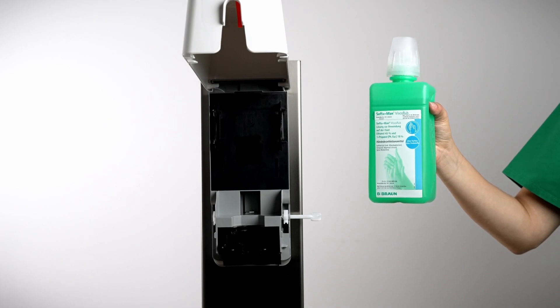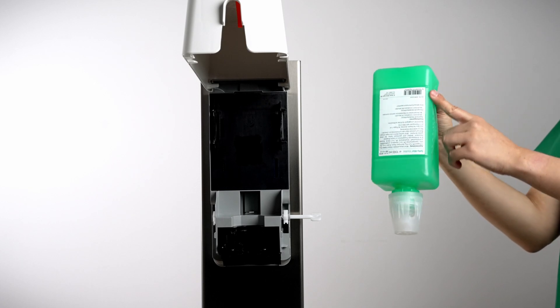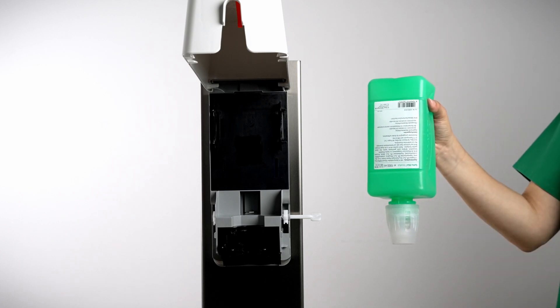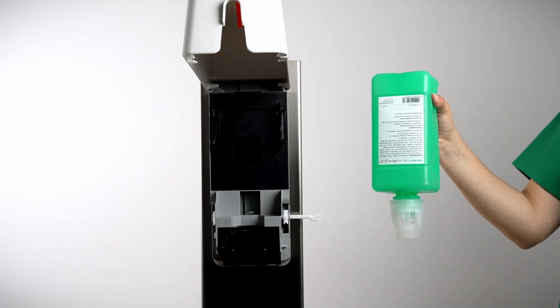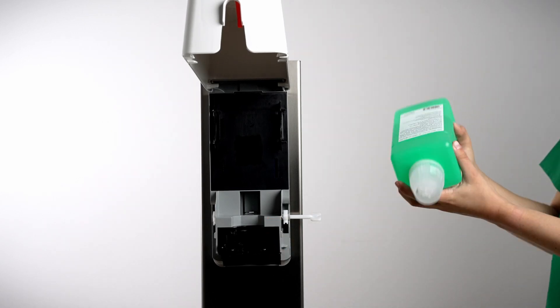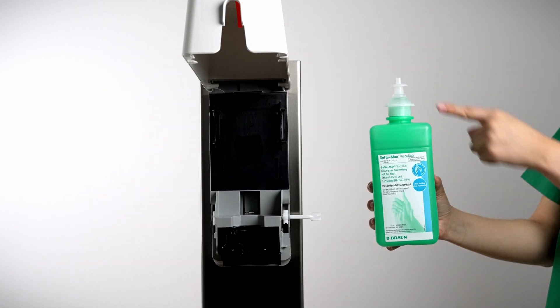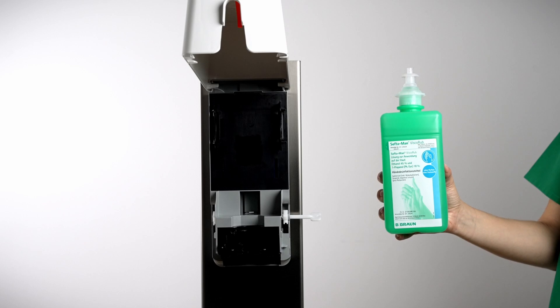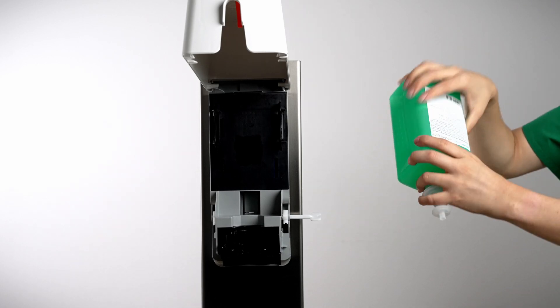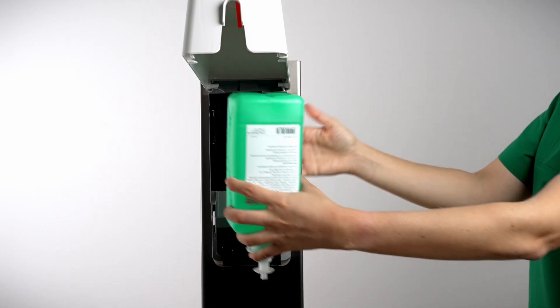The bottle needs to be inserted upside down and with the back label in front. Please be aware that the construction of the wall dispenser is especially made to place the pump of the bottle exactly into the insert. After removing the protective cap, you will see the specialized nozzle, which has two ridges that are designed to hold the bottle securely in the dispenser. Ensure the back label is facing toward you and the nozzle and the bottle fit snugly in the dispenser.